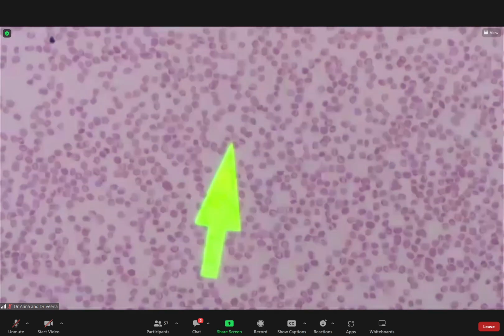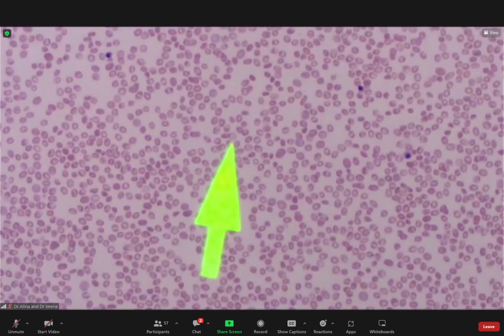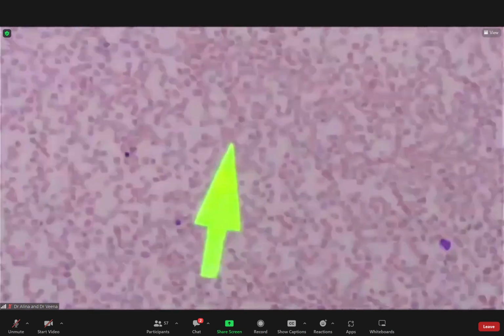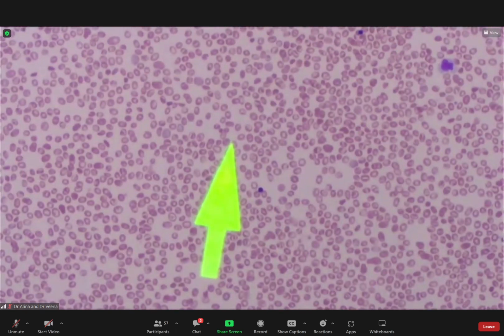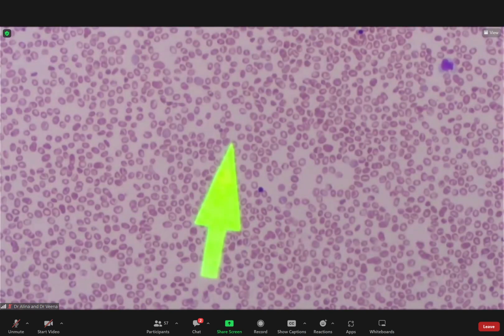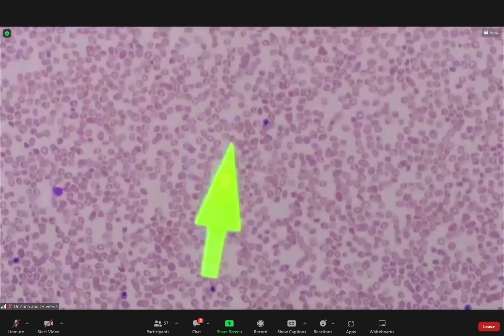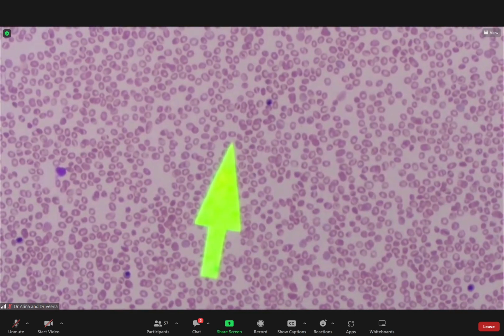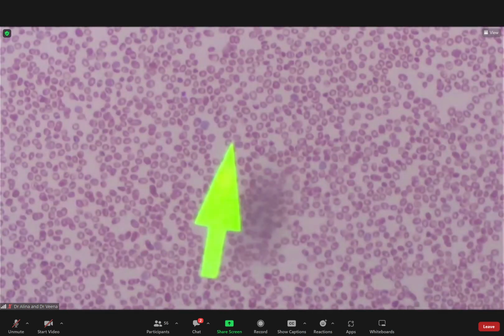Yeah. Okay. Some of you noticed some abnormal lymphoid cells, but unfortunately, sorry to disappoint you, there were no abnormal lymphoid cells, so there was no evidence of relapse. Okay. So for those who said there is evidence of relapse or evidence of abnormal lymphoid cells, perhaps you have to look at more slides and reduce your level of suspicion a little bit. Okay, I think with practice you'll be able to identify what is and isn't abnormal lymphoid cells. All right. So, any questions for this case?